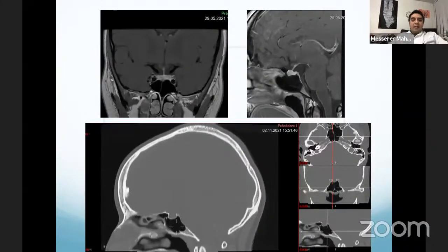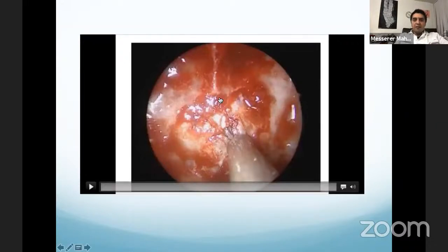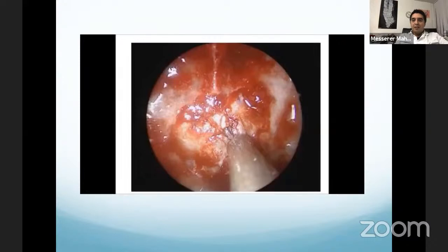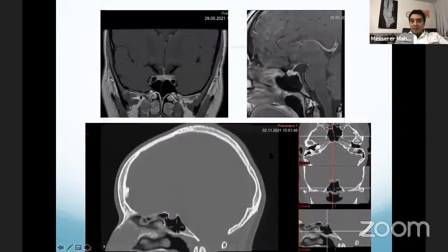And finally, I want to share with you this case. I operated on this case last week. It's a classic microadenoma, Cushing disease. As usual, my resident did the approach. When I was in the OR, I asked him, is everything okay? Yes, everything is okay. He told me this is the sella, this is the lateral opticocarotid recess, and the carotid artery. But we can see here, we have a particular anatomy.